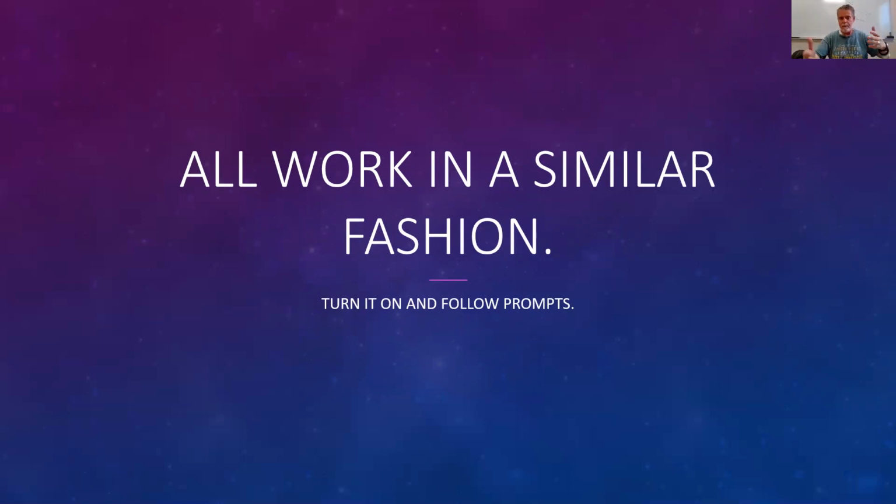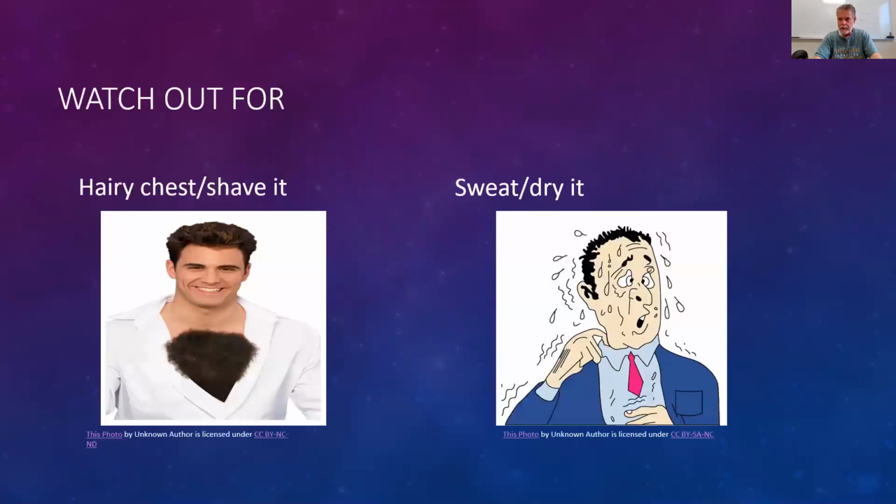There could be some concerns or issues that come up with the AED. I gave you an example of these two here, right? You've got a hairy chest. Well, of course, not you yourself, but your patient. If they have a hairy chest, the AEDs come with razors. It's just a couple of swipes. I'm looking at that chest over there, and that looks like a nightmare. But they are good, high-quality razors that come within the AED itself.